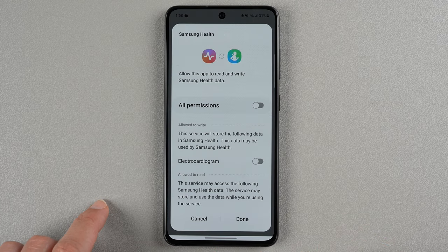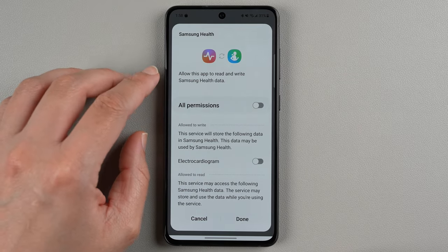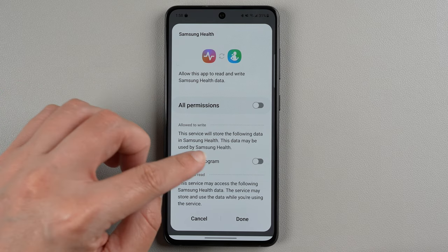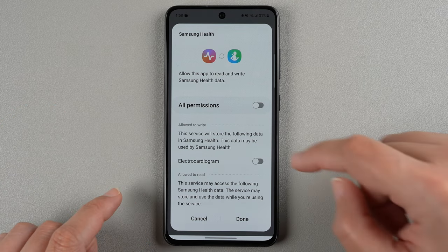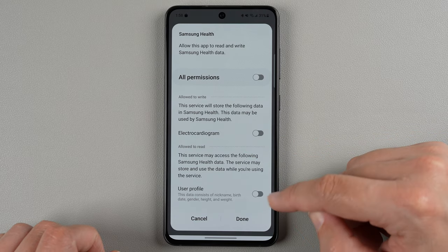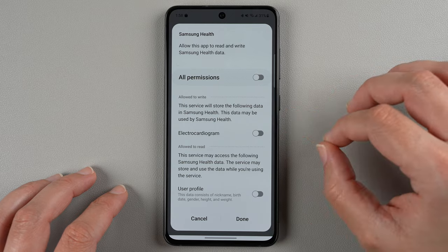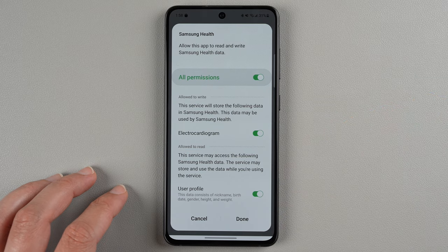Now it's asking for Samsung Health and Samsung Health Monitor to be able to communicate — allow this app to read and write Samsung Health data. Basically it's the electrocardiogram, which is ECG for short. It's wanting to write the data and also read your user profile, which includes things like your age, gender, height, weight, and things like that. I'll go ahead and tap all permissions — both are now green — and then tap done.